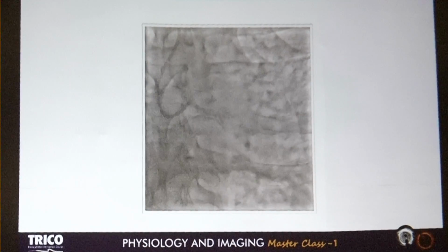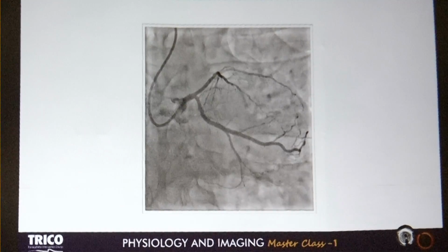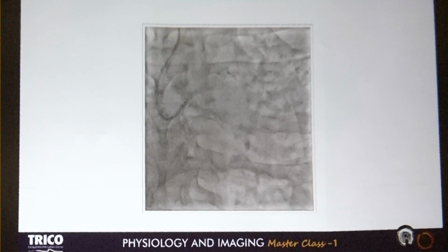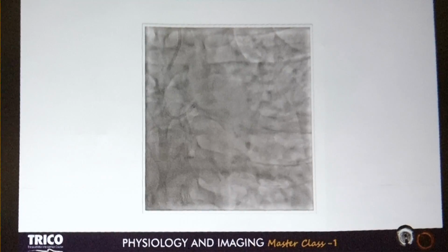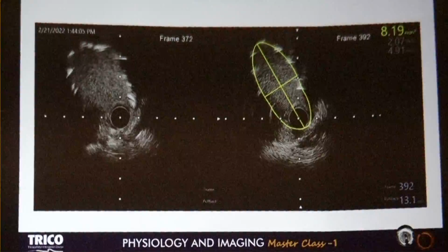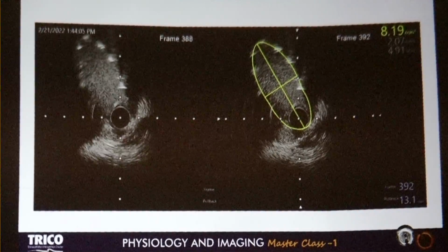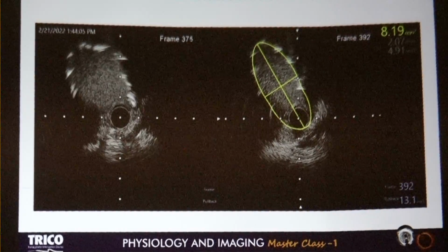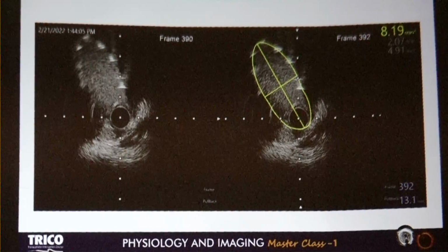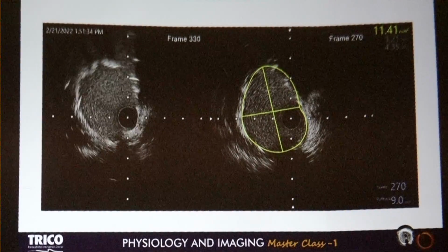But any time we are doing left main ostium with IVUS, after stenting, we pull our guide catheter back in the aorta a little bit, keep it hanging, and then we interpret the IVUS. And this was what it was. We injured the stent strut at the origin, and the circular lumen was completely oblong in that region with 8.19 MSA. And we corrected it. After correction, it became 11.41.